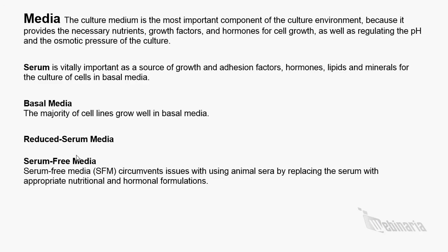Media. The culture media is the most important component of the culture environment because it provides the necessary nutrients, growth factors, and hormones. Although initial cell culture experiments were performed using natural media obtained from tissue extracts and body fluids, the need for standardization, media quality, and increased demand led to the development of defined media.